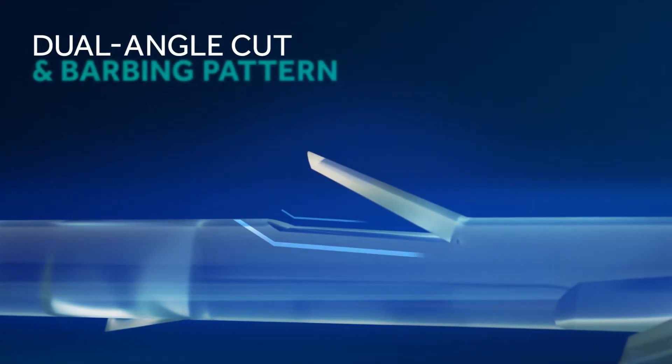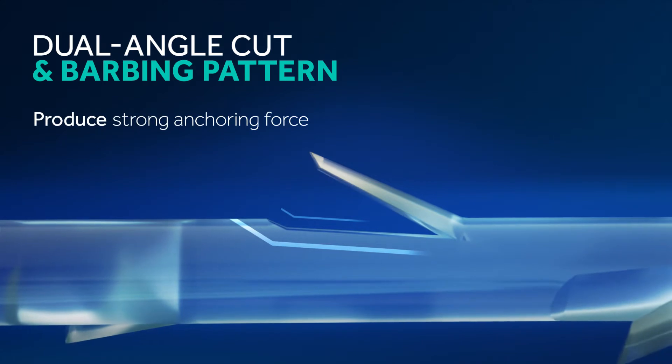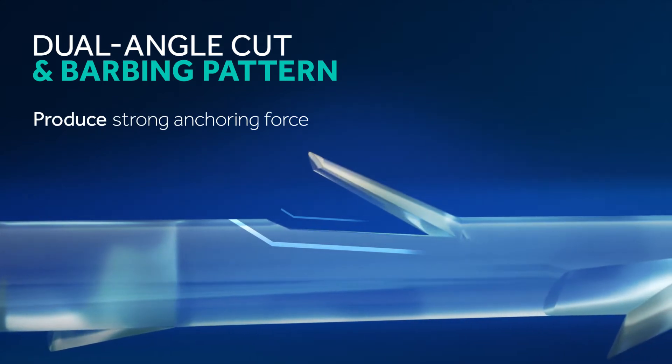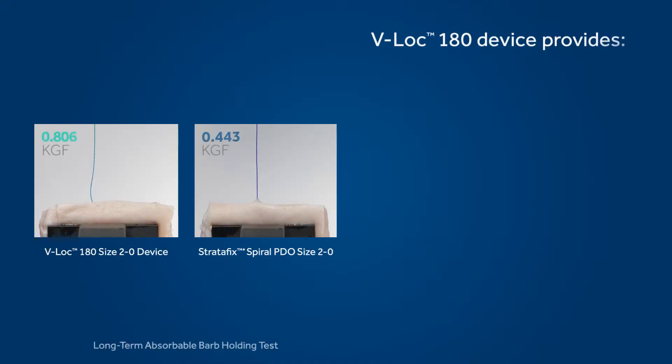The difference is the unique dual-angle cut and barbing pattern of the V-Lock device that produce barbs with strong anchoring force. At the same time, they preserve the integrity of the strand's strength.